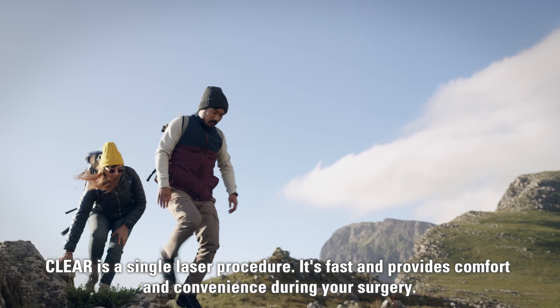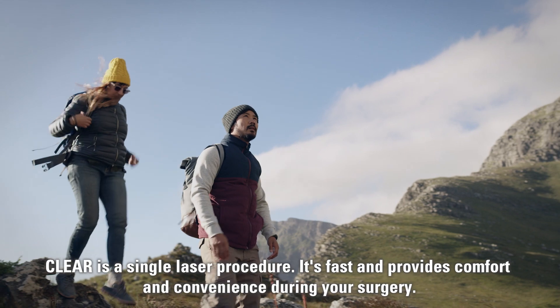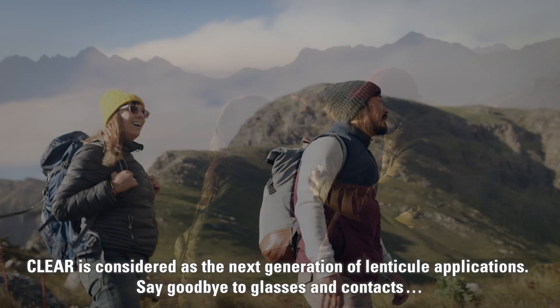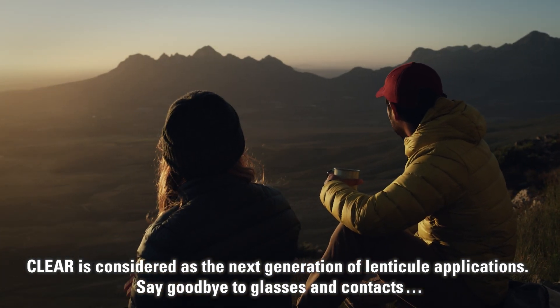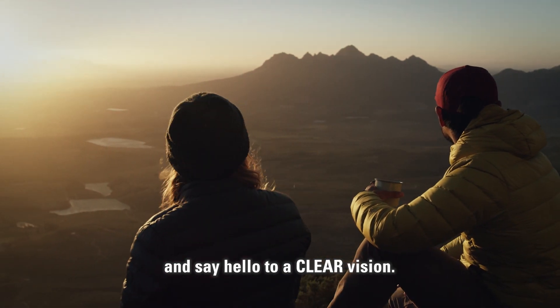Clear is a single laser procedure. It's fast and provides comfort and convenience during your surgery. Clear is considered the next generation of lenticule applications. Say goodbye to glasses and contacts and say hello to clear vision.